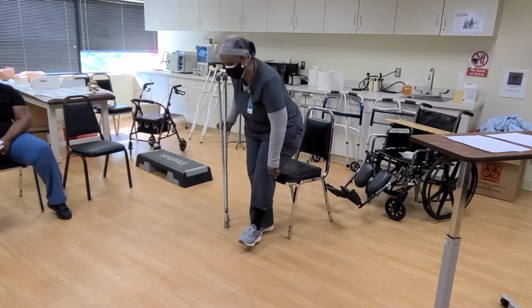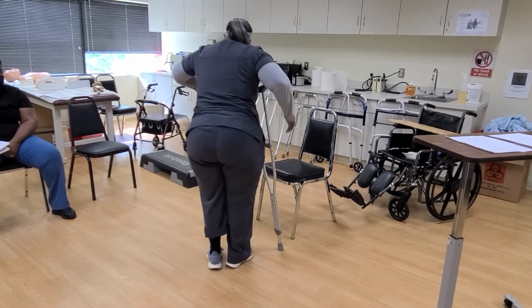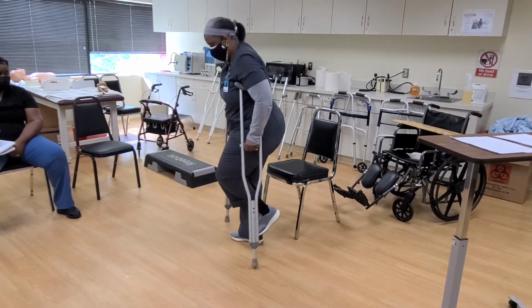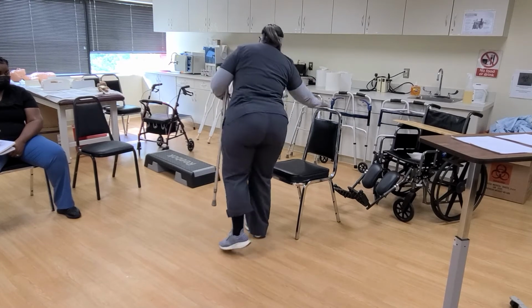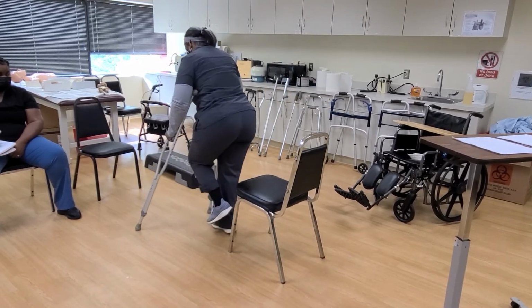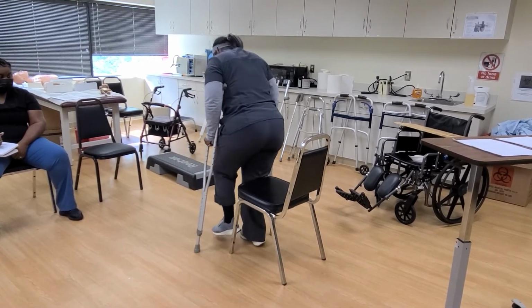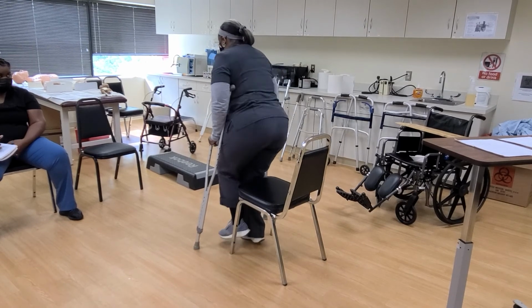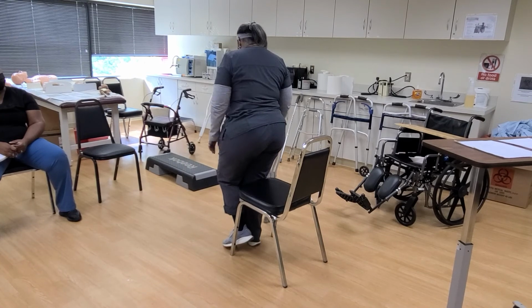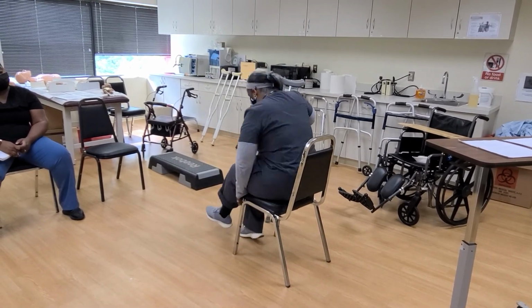Same thing. If I was walking towards it, I'll do it this way so you can see from this angle. I'm going to back up so I can feel the chair. I'm going to move the crutch to this side. Both hands, I would hold the rail or the side here and sit down.